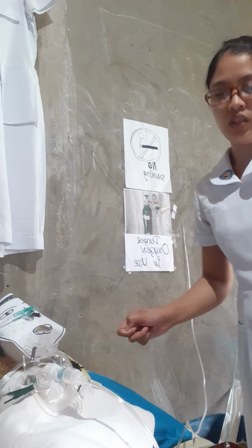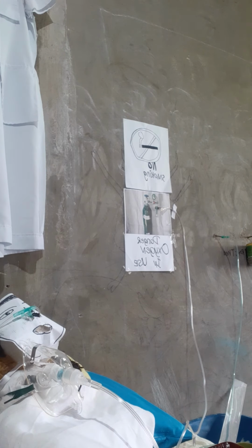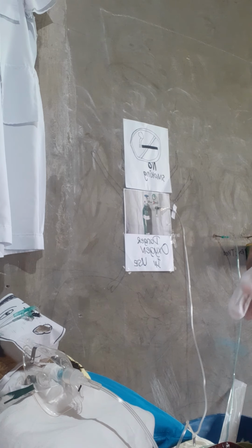Afterwards, we need to put on disposable gloves.